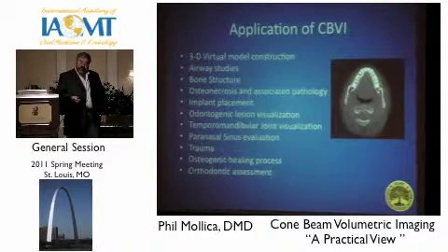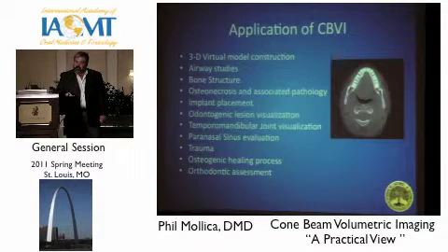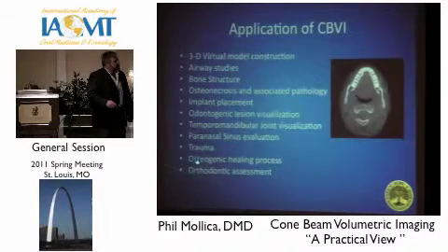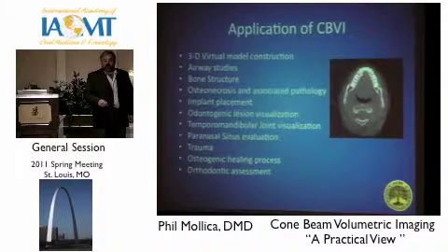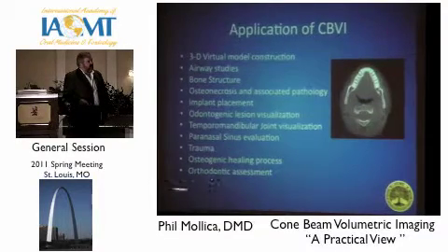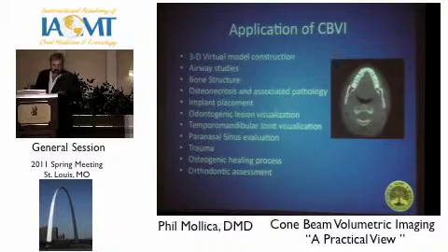It's amazing how much the sinuses are involved in these infective states, and I don't know if we're recognizing that a lot. So we don't know what the horse and the cart is. And of course, traumatic issues, and we're looking for osteogenic healing processes, things that indicate there's healing going on. And of course, my pal Bob Harris loves coming in and talking about orthodontic assessment and all the orthopedics with that. He's great with that.